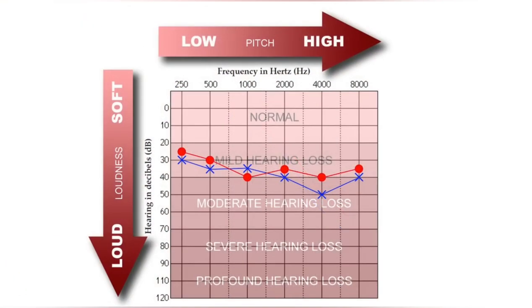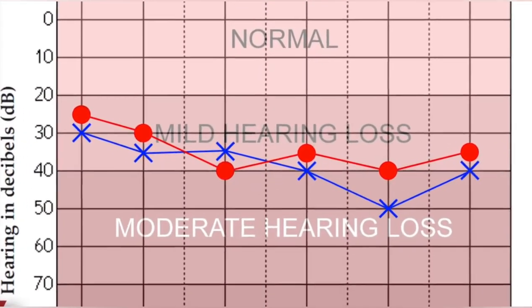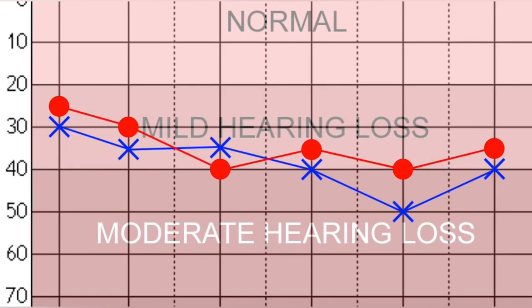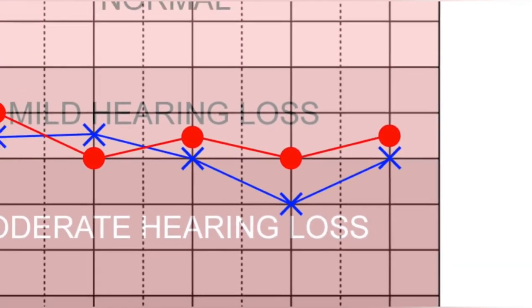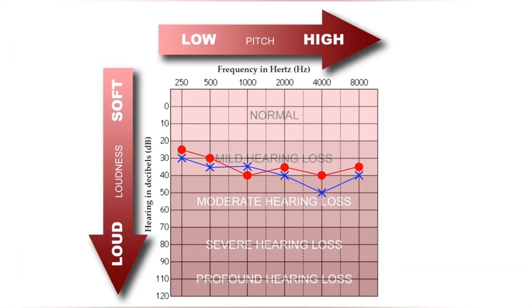In this next example, the person's hearing falls regularly within the mild hearing loss category, except at 4,000 hertz, where it drops slightly into the moderate hearing loss area. Congratulations, you now know how to read an audiogram.